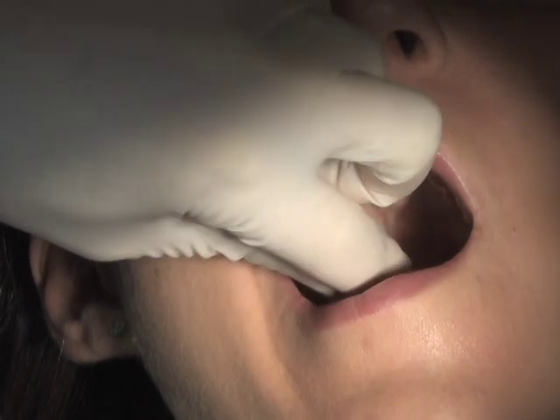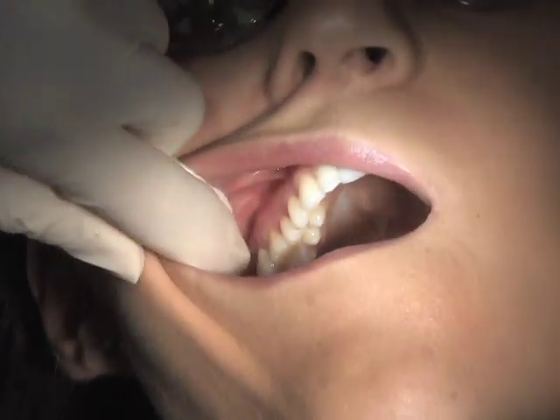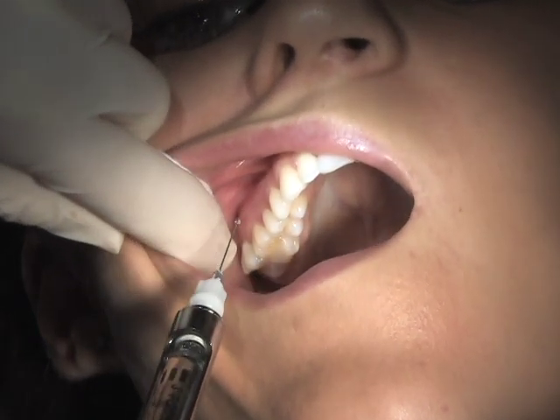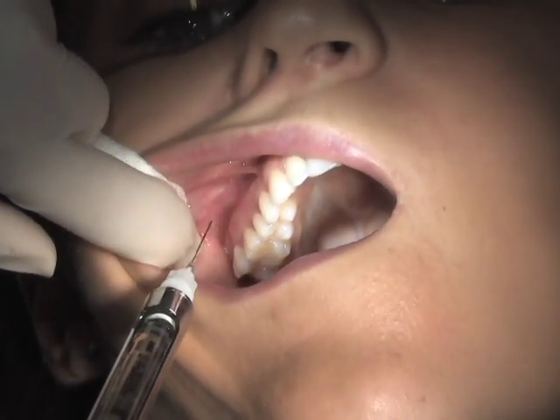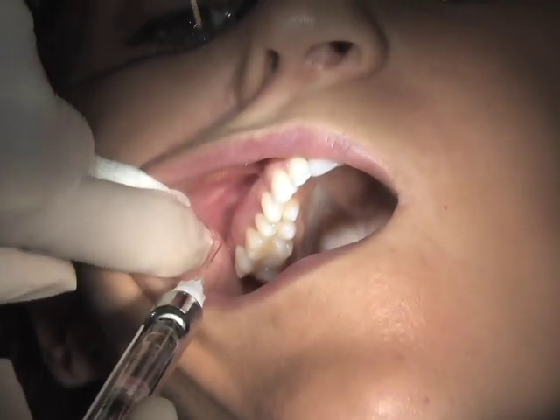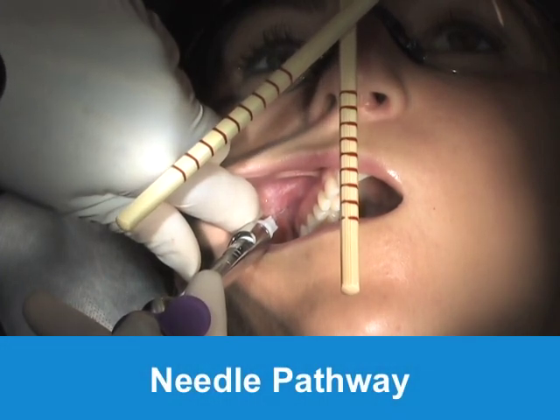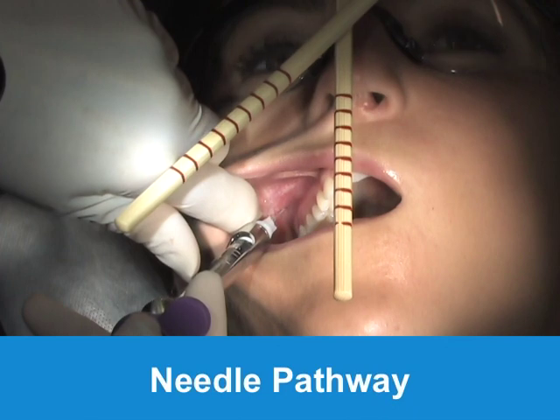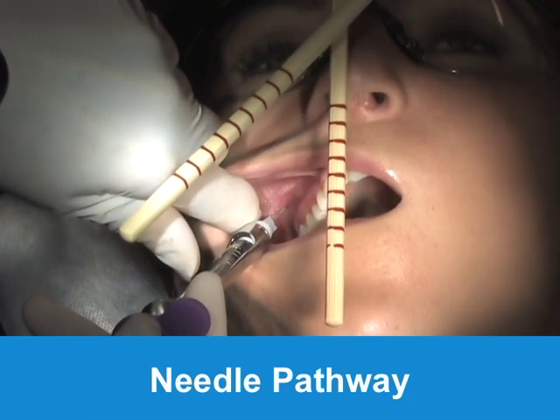To gain access to the site of the penetration, retract the lip outward and upward. Be sure that the penetration site is not too medial or you will contact bone — bone should not be contacted at any time with this injection. The pathway of the needle is at a 45 degree angle to the occlusal plane and a 45 degree angle to the midsagittal plane of the maxillary molars.